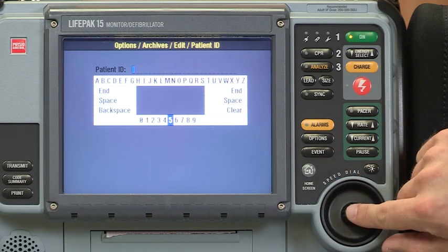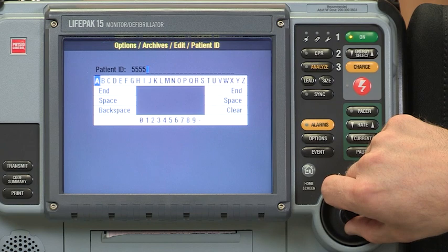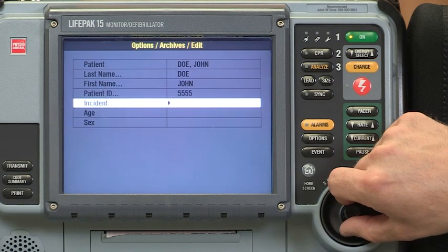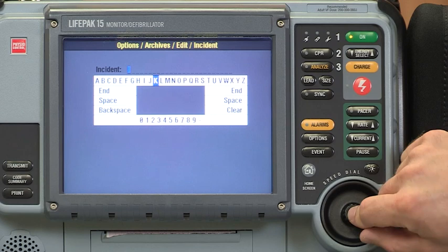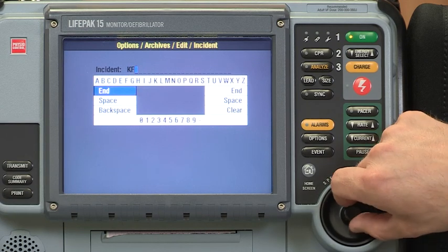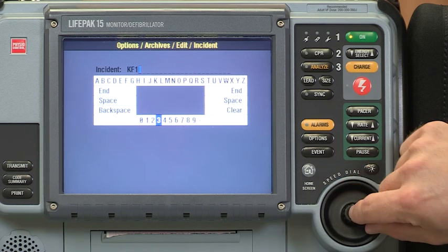For the demonstration, we'll just use 5,555. Go to End again, and then we'll go to incident number. For us, this will be KF, so we'll select K, F, and then the year. Just the last two of the year, so we'll do 13.